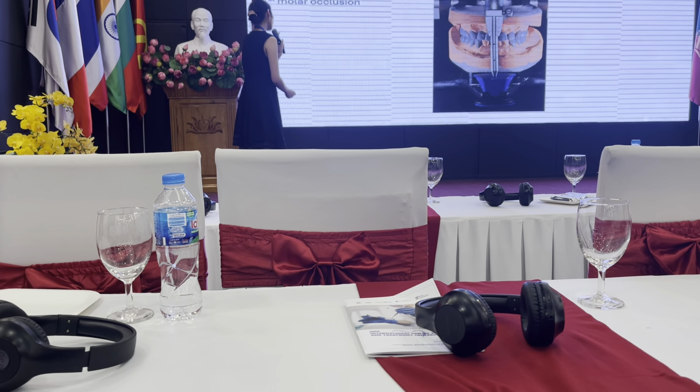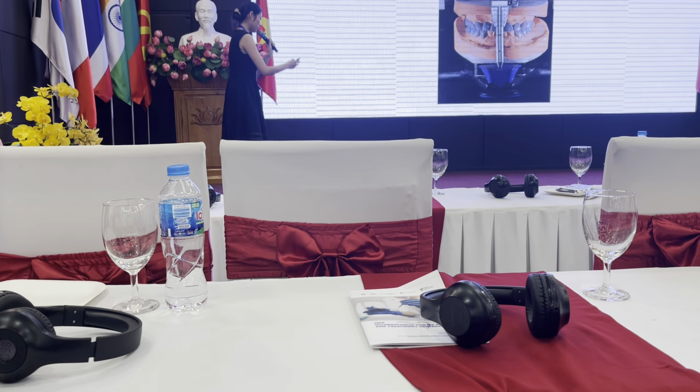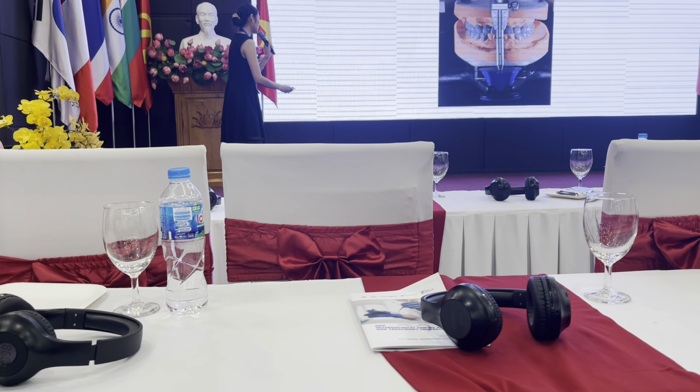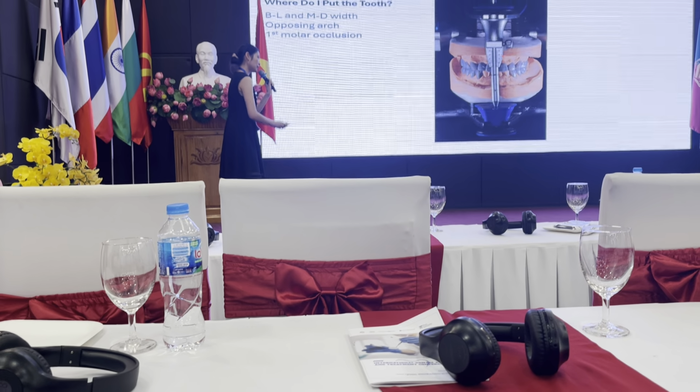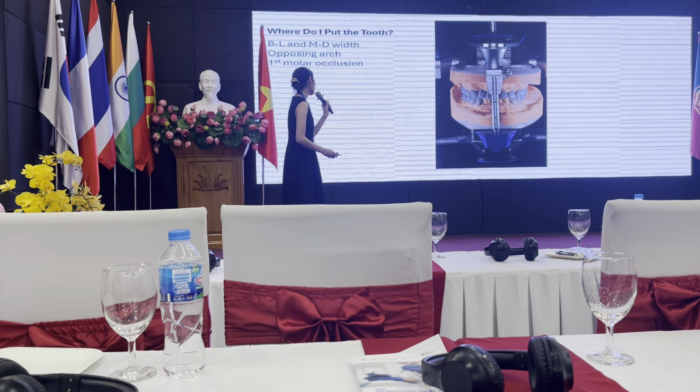What we can do is go back to the analog workflow. So after you take your diagnostic cast, in cases where we are not sure about the plan, you can have a better idea about the dimension, buccal apicocoronally, about what implant size you want to have.